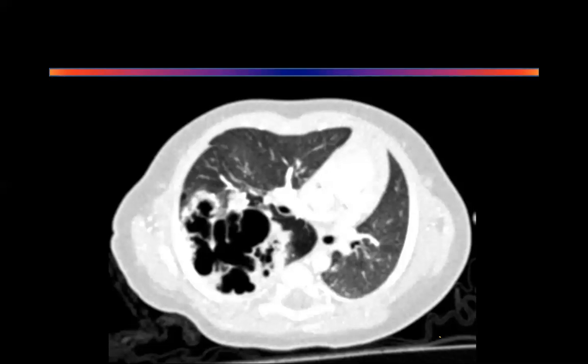I like the answer of hernia because you cannot see everything from top to bottom. But this looks as if it's more invading into the lung. It's part of the lung; you cannot see a sac. If it's a hernia, then you would actually see a sac surrounding it. So hernia is less likely, more likely a lung pathology. Okay? So CCAM. This is a CCAM. Happy with this?